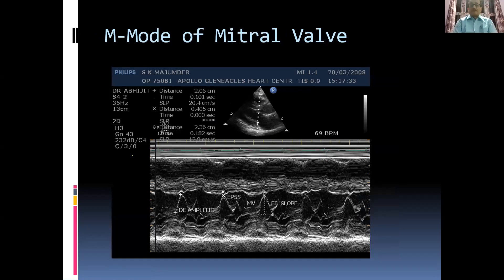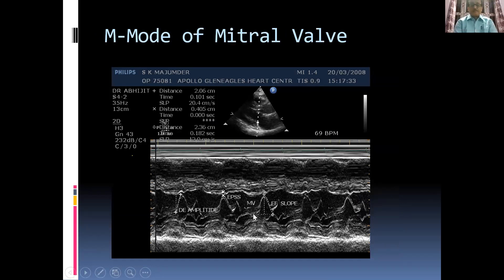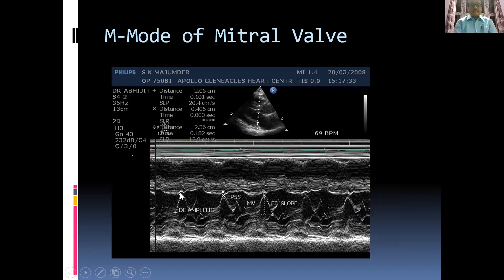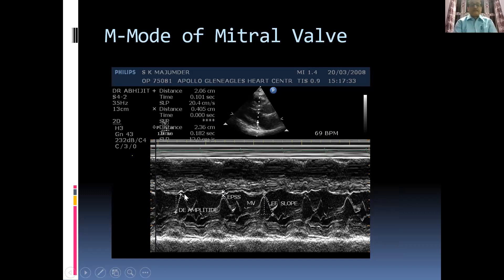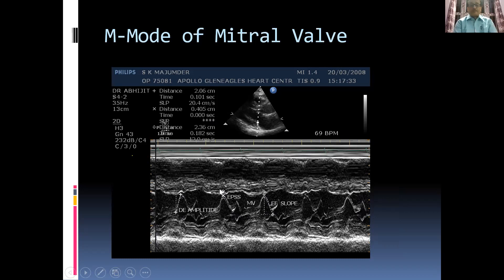This is an M-mode picture of the mitral valve, showing the tracing of the anterior mitral leaflet. The DE amplitude, the EF slope, and the E-point septal separation are visible. From D to the peak of E is the E amplitude; from E to F is the EF slope; and from E to the septum is the E-point septal separation. These measurements are of historical importance only.